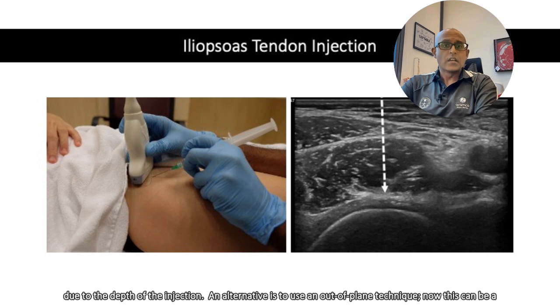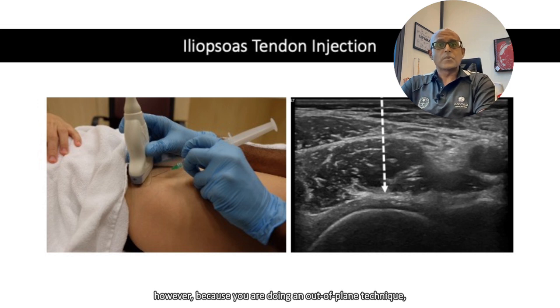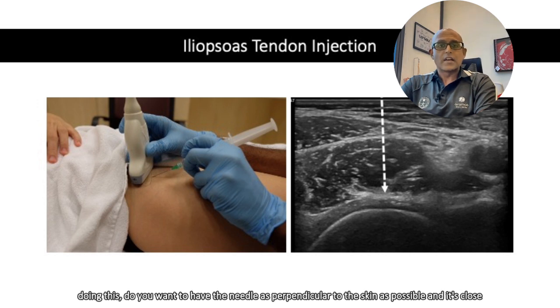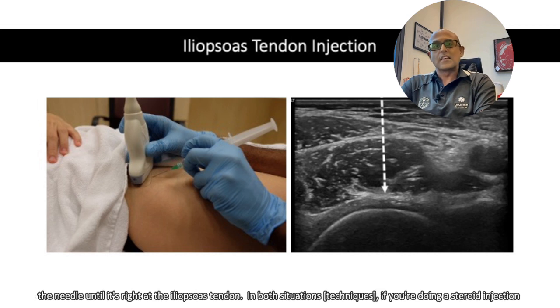An alternative is to use an out-of-plane technique. Now, this can be a little bit trickier. However, because you are doing an out-of-plane technique, you will generally traverse less tissue and it will be much more direct in and around the iliopsoas tendon. When doing this, you want to have the needle as perpendicular to the skin as possible and as close to the long axis or long border of the transducer. When using the out-of-plane approach, you might not see the needle until it's right at the iliopsoas tendon.